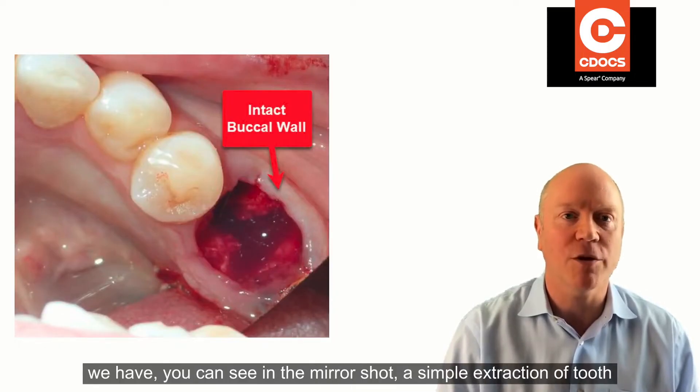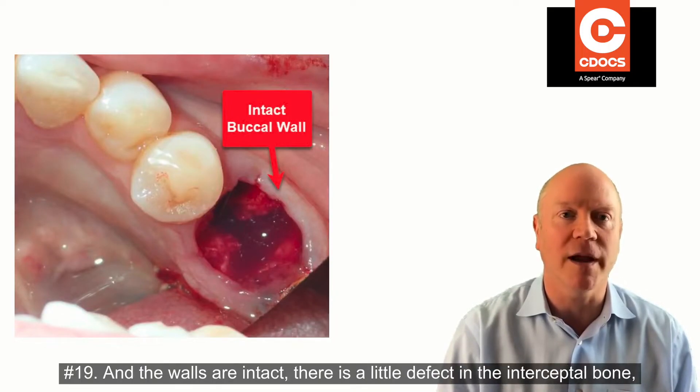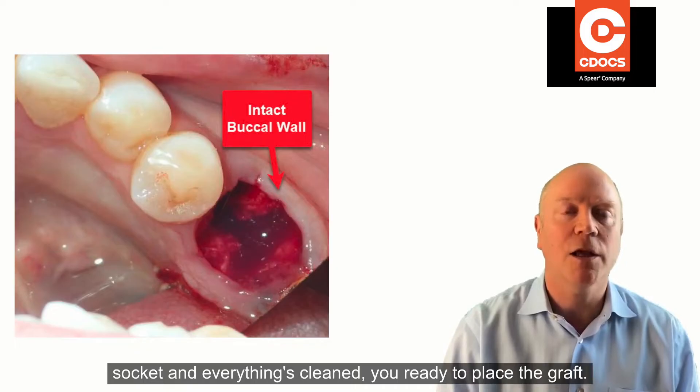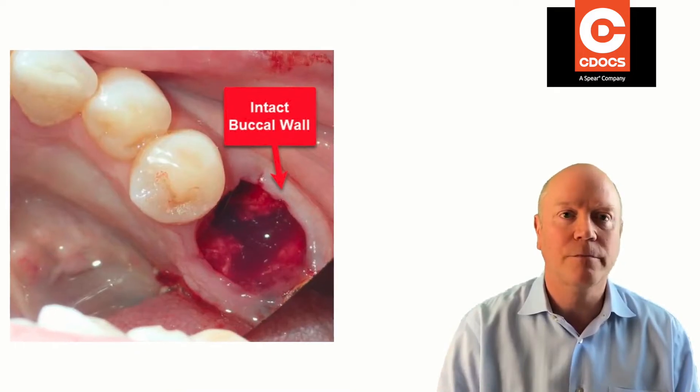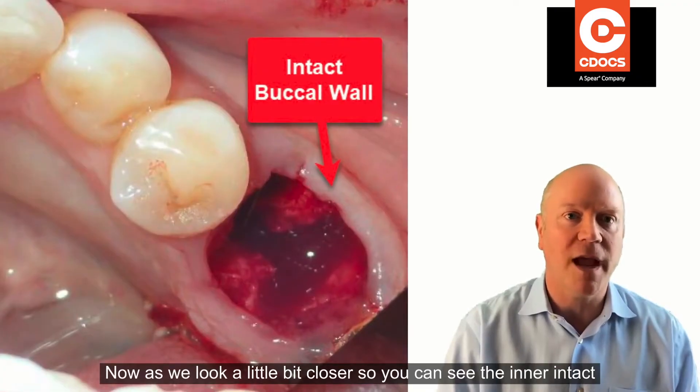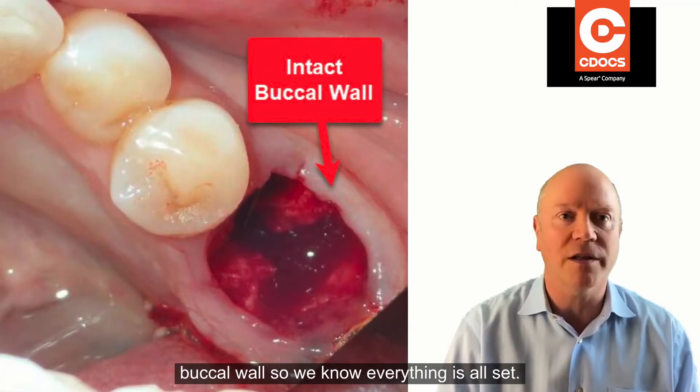Here we have, and you can see in the mirror shot, a simple extraction of tooth number 19. The walls are intact — you can see a little defect in the intercrestal bone, right where the mesial root popped out. Once you've curetted the socket and everything's clean, you're ready to place the graft. Looking closer, you can see the intact buccal wall, so we know everything's all set.